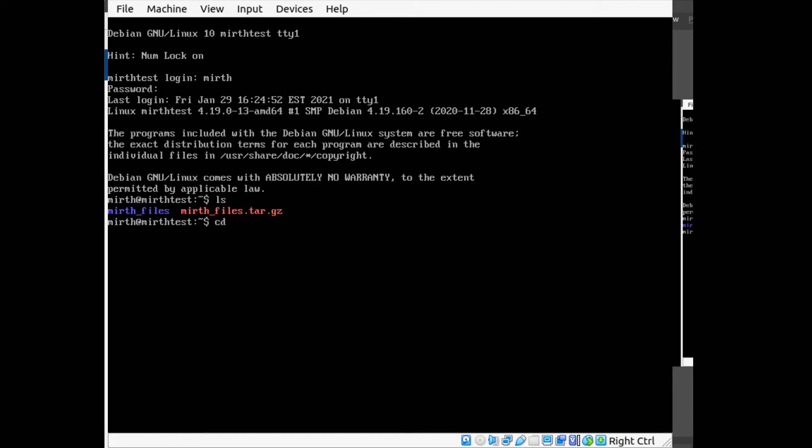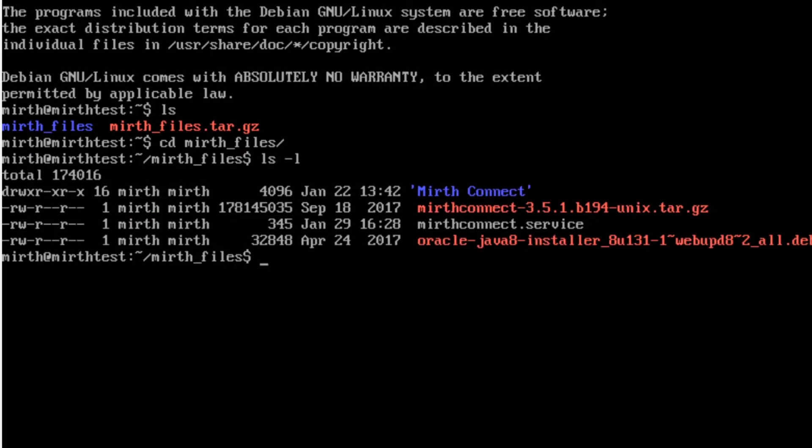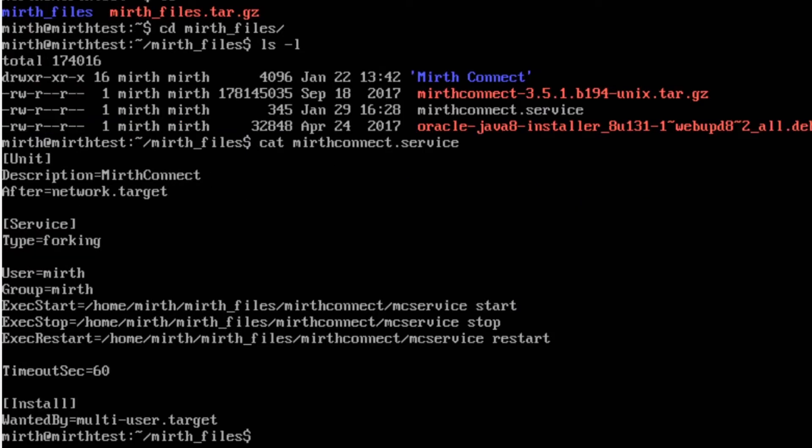If I go into the MIRTH files folder you can see there's a file in here called MIRTH Connect dot service.